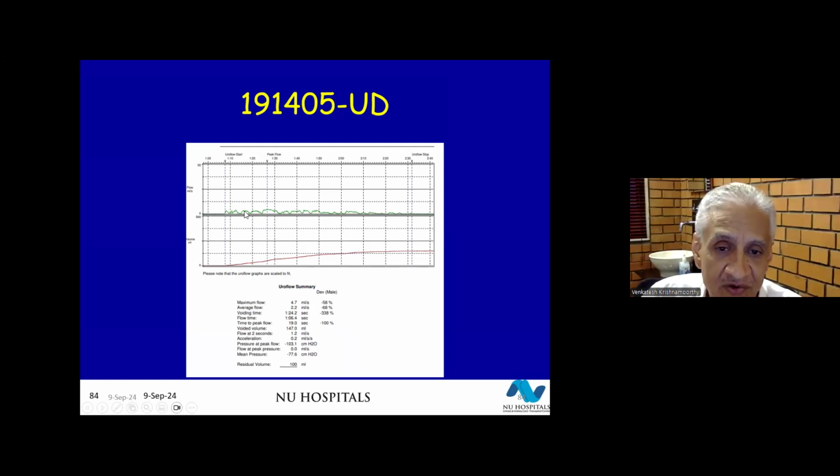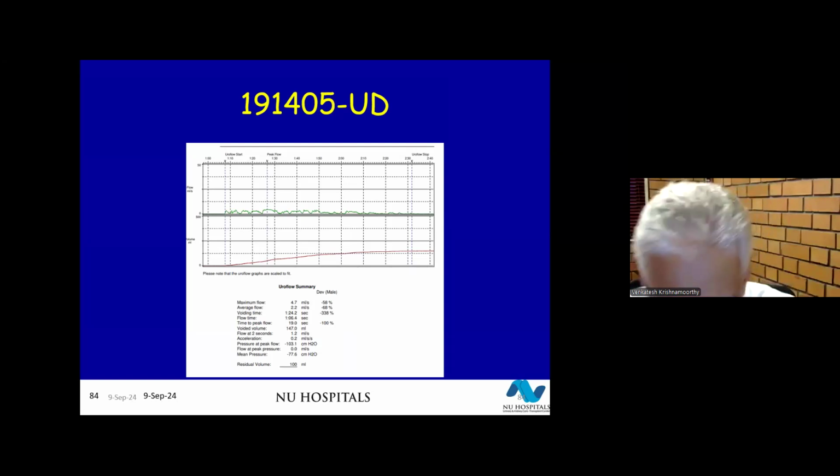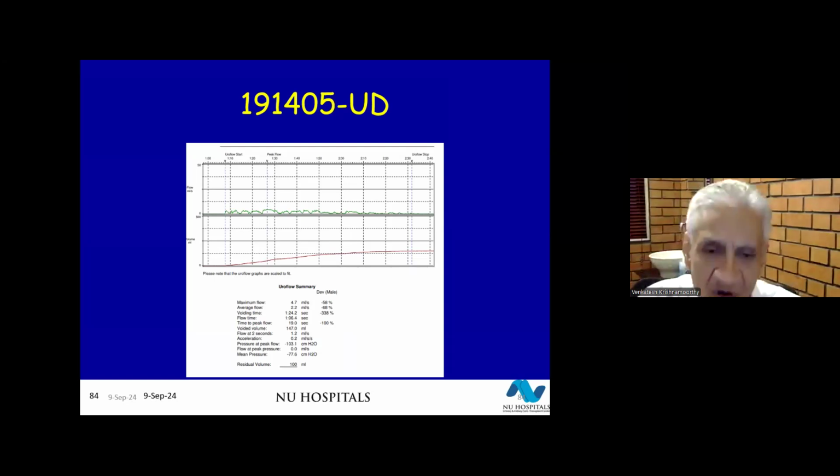Anyone? Jamin, do you want to say what this is? Sir, again, it could be due to either a stricture or dysfunctional voiding, sir. Yeah, correct. What is right, meaning when you say that I consider these possibilities, you're very right, because the uroflowmetry can only tell you that it is good, maybe good, but may still have a problem, or that it is a bad flow. So the next 3-4 slides are all of underactive detrusor.